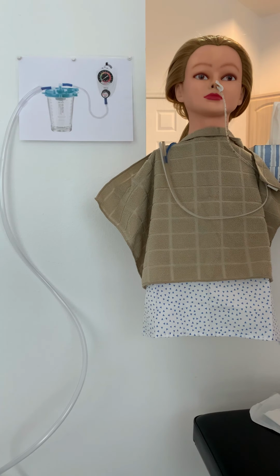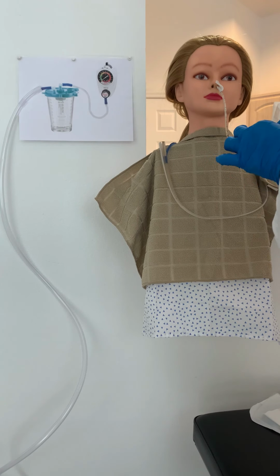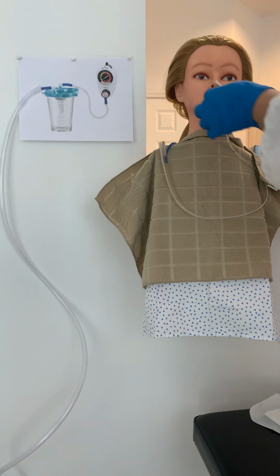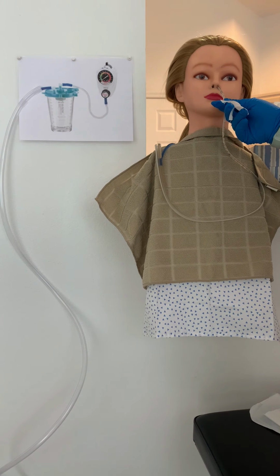Okay, so now let's put a better piece of tape or a securement device to hold that tube in place. So I rip off a piece of tape. I'm going to rip lengthwise. If I can get it to rip. Okay. So we'll just go down a little ways like that. Okay. We're going to take this piece of tape off, but make sure we don't pull our tube out in the process.